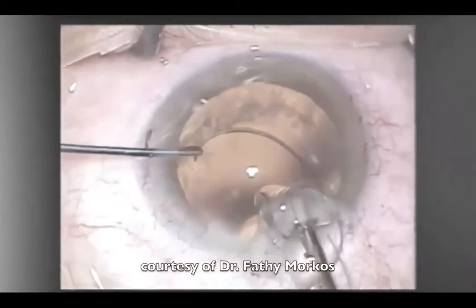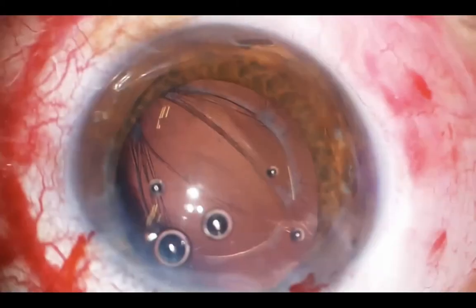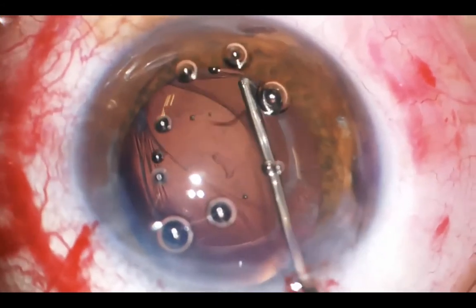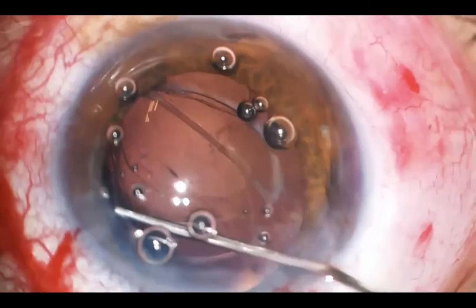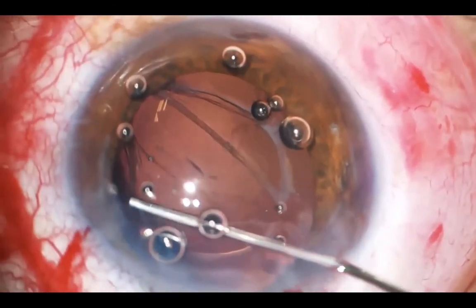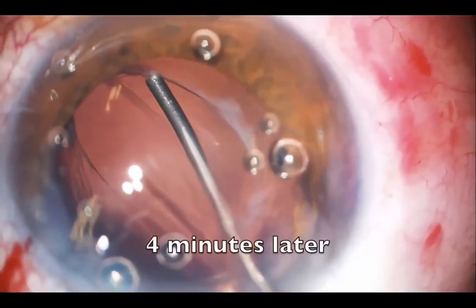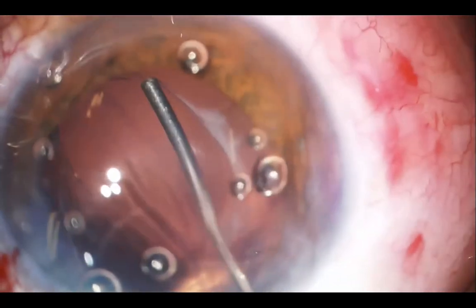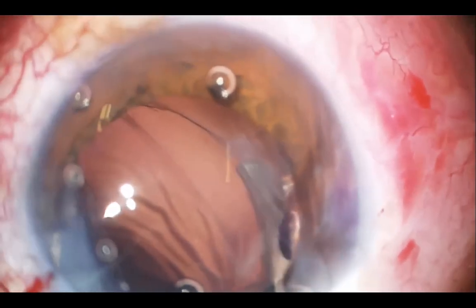So I decided, why not give it a try and try to open these leaflets, or to dissect the adhesion between the anterior and posterior leaflets, and try to implant a single piece lens inside the capsular bag. Although this situation is a little bit more complicated because we have an open posterior capsule, I kept trying for several minutes to dissect these adhesions.